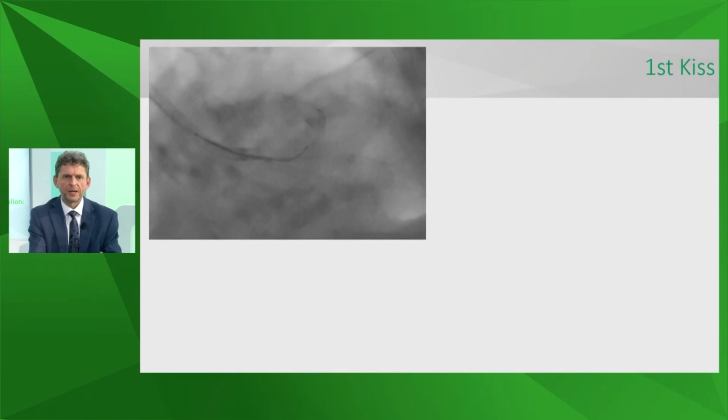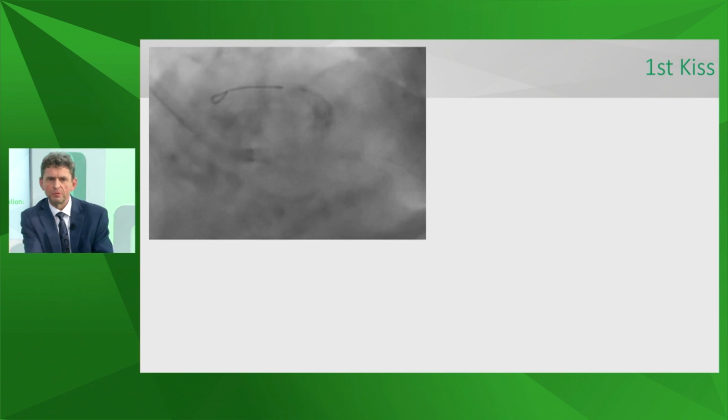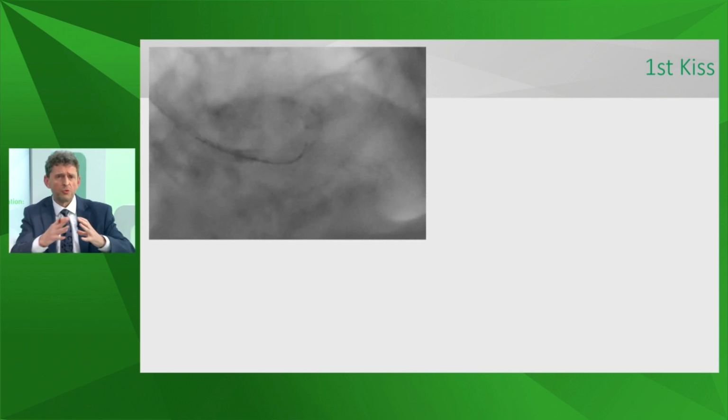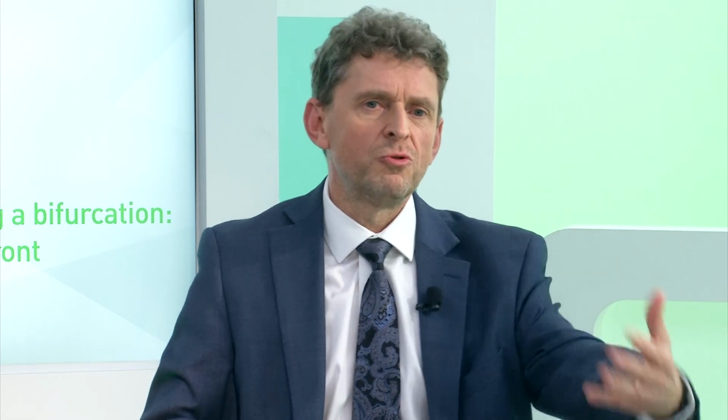It may be really sometimes difficult. One thing very important here is to crush a stent with an adequately sized balloon. So if my regular wire doesn't go, then I'll take a bigger balloon and do the crushing again, or the POT, or other techniques to overstretch the struts of the stents to make the cells bigger, and then in many cases it works. If not, I really do try to do my best with the regular wires like BMW or Sion Blue before I move to another step of stiffer or hydrophilic wires, because you may expect some problems.